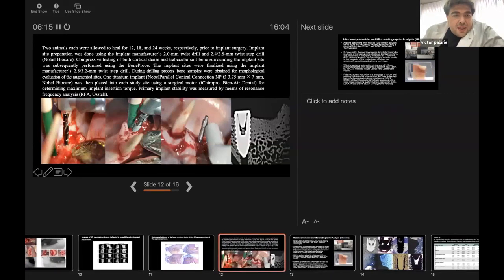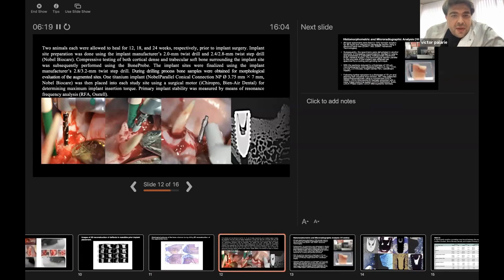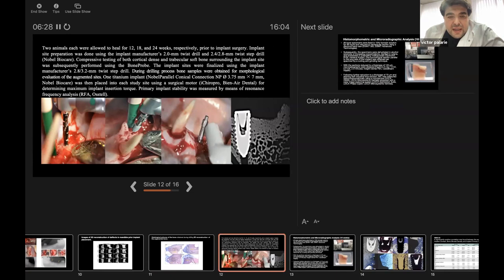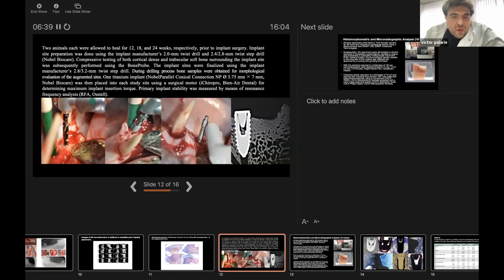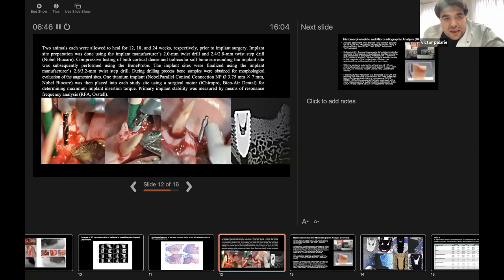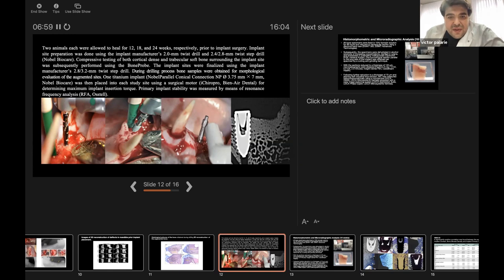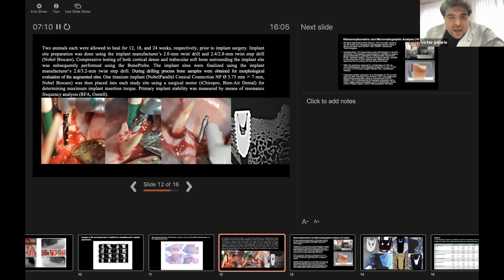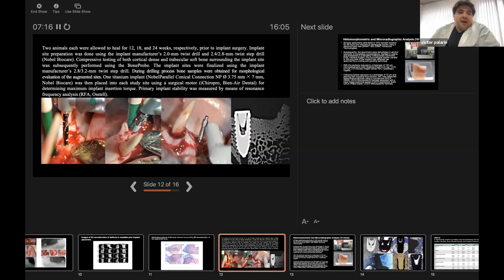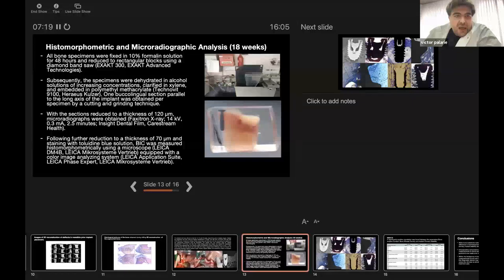For implant placement, two animals each were allowed to heal for 12, 18, and 24 weeks respectively prior to implant surgery. Implant site preparation was done using the implant manufacturer's protocol: 2 millimeter twist drill continuous, 2.4 in the apex and 2.8 millimeter twist drill in the neck. Compressive testing of both cortical dense and trabecular bone surrounding the implant site was performed using the bone probe device. The implant sites were finalized using the implant manufacturer's 2.8 in the apex and 3.2 millimeters in the neck twist step drill. One titanium implant of parallel conical connection of diameter 3.75 and length 7 millimeters from Nobel Biocare was placed into each study site using a surgical motor iChiroPro for determining maximum implant insertion torque.